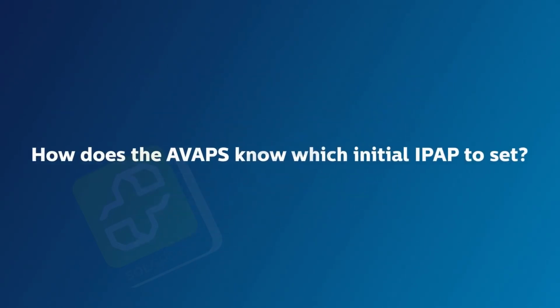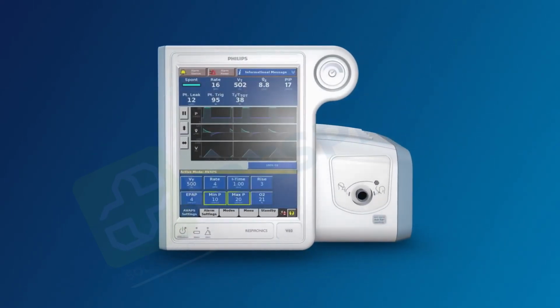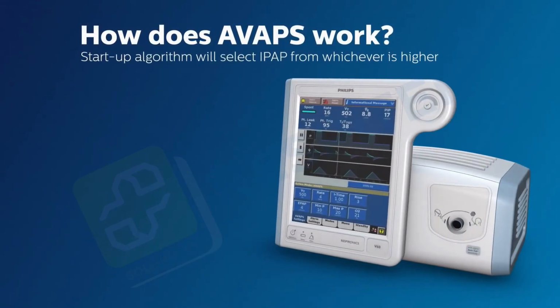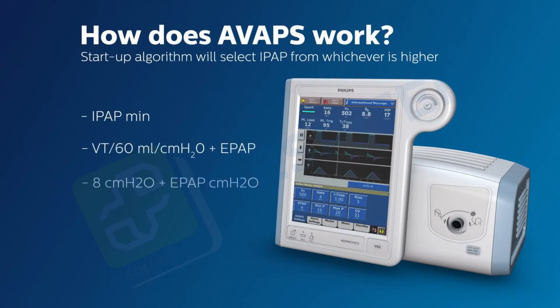How does the AVAPS know which initial IPAP to set? In other words, even though you set a range, how does AVAPS know with which pressure to begin the first breath? And the answer is, AVAPS has a startup algorithm and will automatically select whichever value is higher. So sometimes out of these 3 methods, the minimum IPAP will be the highest value and therefore will be the initial IPAP setting. Or maybe this calculation here will produce the highest value out of the 3 choices, and so this value will be the initial IPAP.